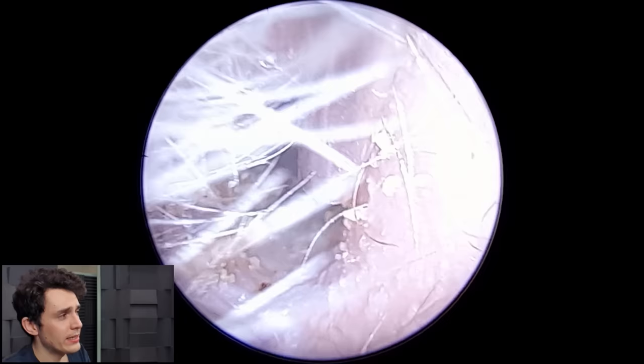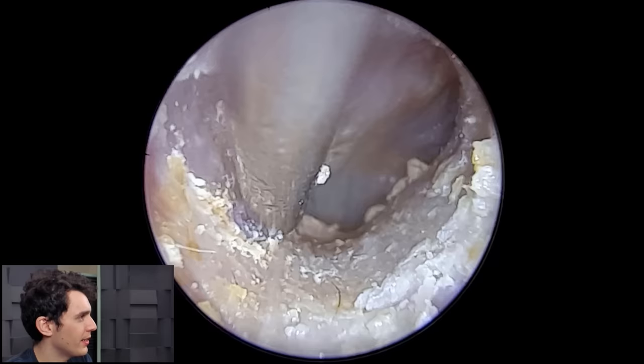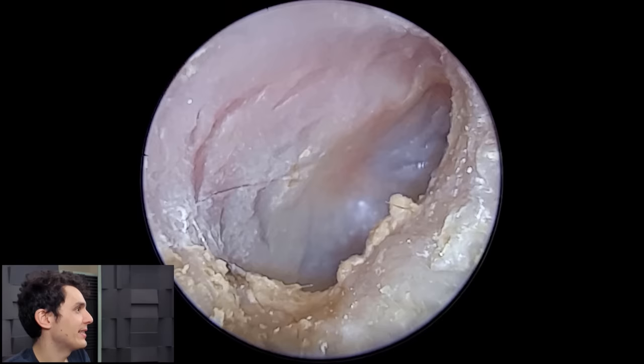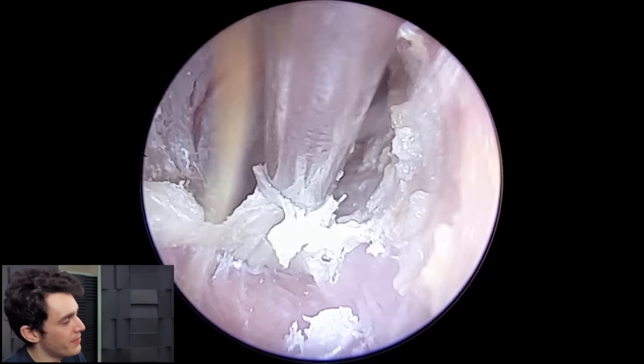We'll have a look at the eardrum once this little piece is out of the way. The eardrum normally appears as a grey disc at the end of the ear canal — I'll mark it with an arrow so you can see it — it's right there. It's not super clear because it's covered with a film of white dead skin, but overall the canal is fairly clear. I'm just peeling the remaining skin with the suction probe, trying not to apply too much downward pressure, just catching it and peeling it upwards.